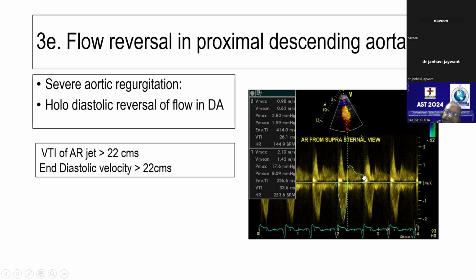End diastolic velocity. What is the application of end diastolic velocity? More than 22 centimeters. Remember 22, 22. Same. VTI 22, end diastolic velocity 22. That is severe AR. Severe AR. It's written over here.